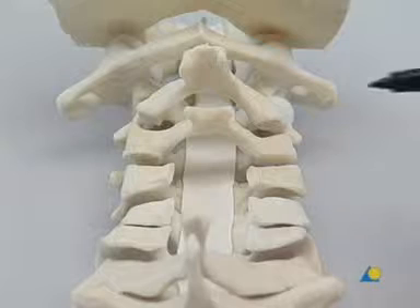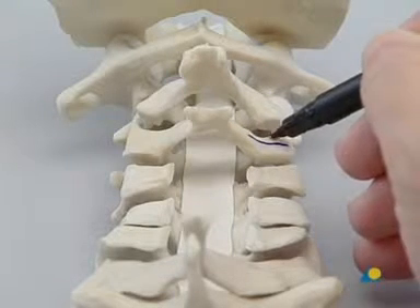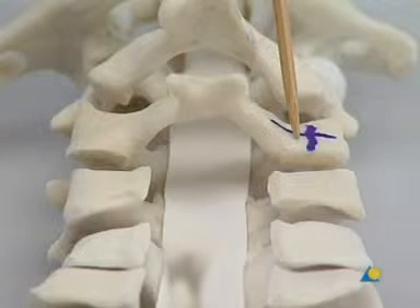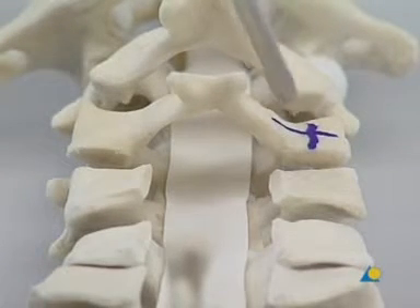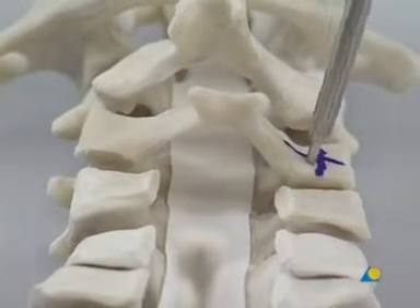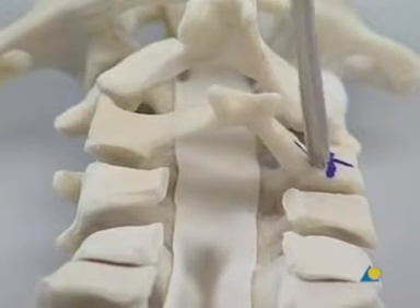The center of the lateral mass is located. The entry point of the lateral mass screw is found 2 millimeters medial and 2 millimeters caudal to the center of the posterior aspect of the lateral mass. A pilot hole is created with the awl. This hole helps to prevent the drill from being displaced when it is first inserted.